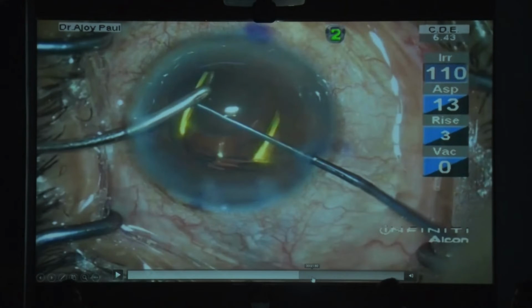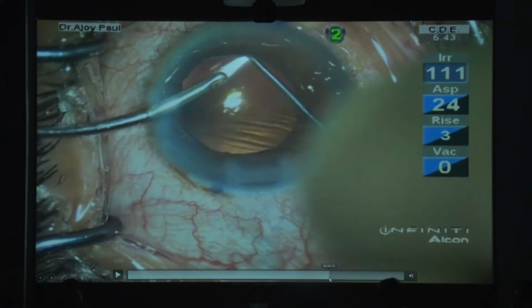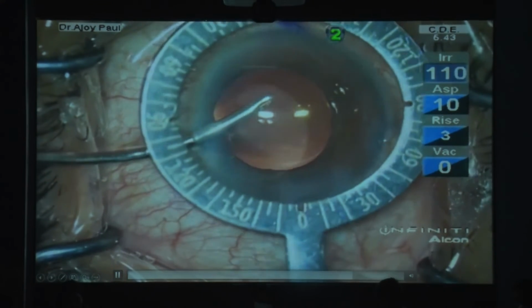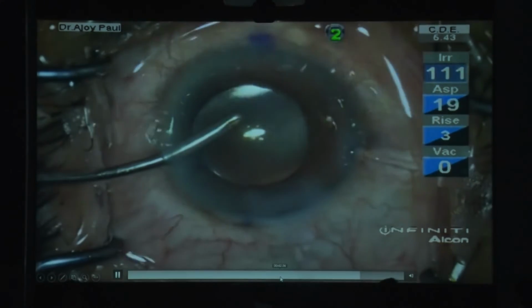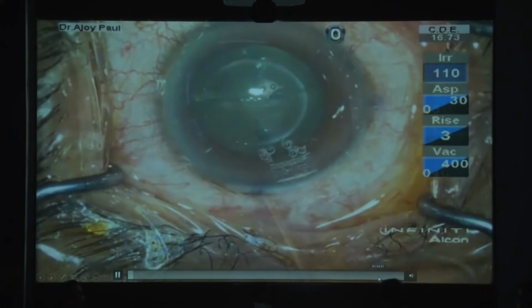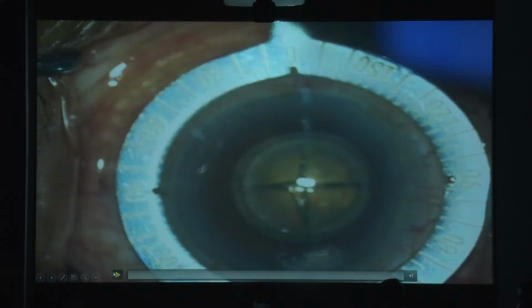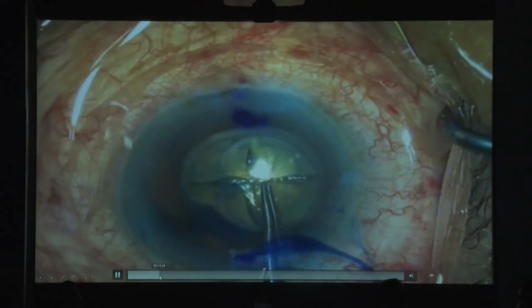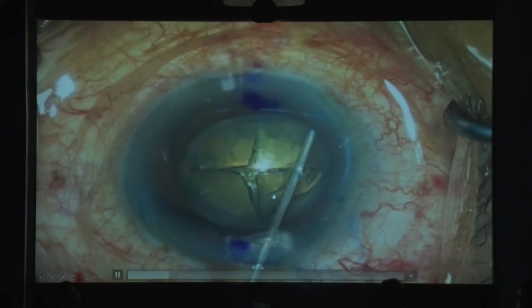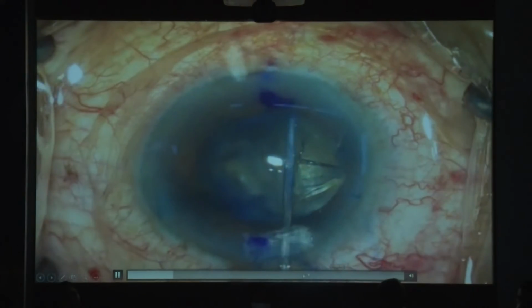In case you are expecting a small pupil, you can put a mark there also, and then at the end of the surgery just recheck whether the marks are okay, and that gives us a really good result. And this is again one patient where the pupil has become small, and we marked it blue because we expected the pupil would get small by the end of the surgery.